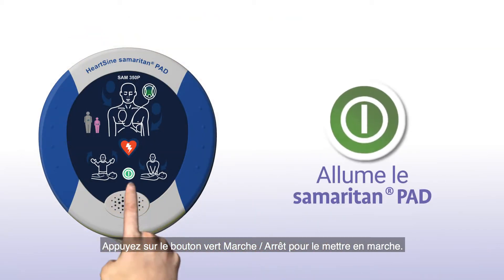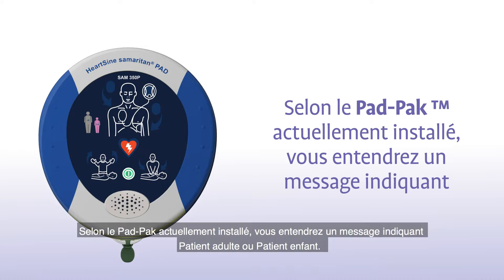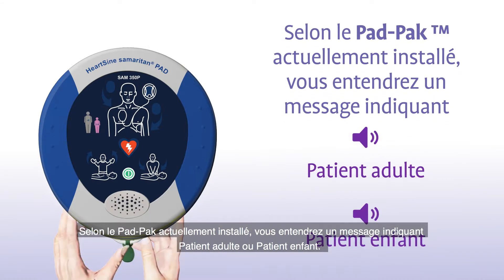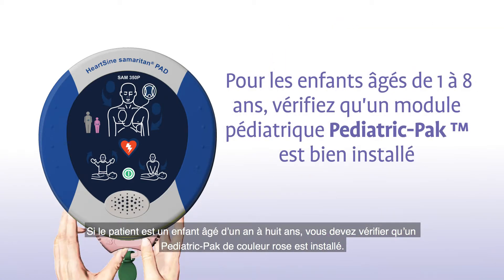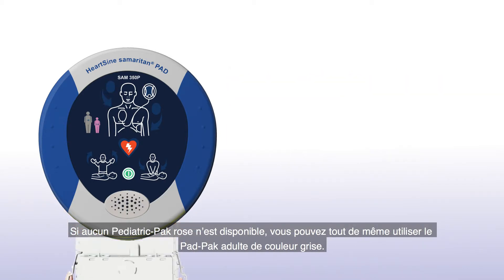Press the green ON-OFF button to turn on the Samaritan PAD. Depending on the pad pack currently installed, you will hear either an adult patient or a child patient prompt. If the patient is a child between 1 and 8 years of age, you should ensure a pink paediatric pack is installed. If a pink paediatric pack is not available, you may use the grey adult pad pack instead.